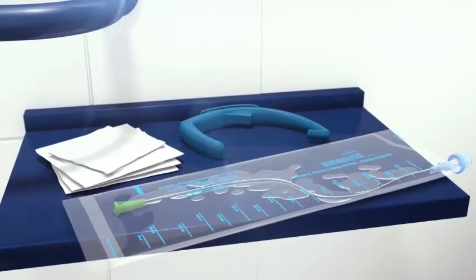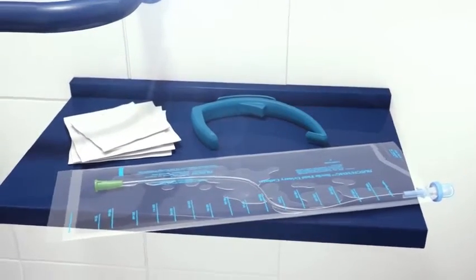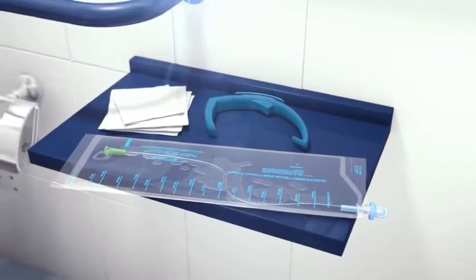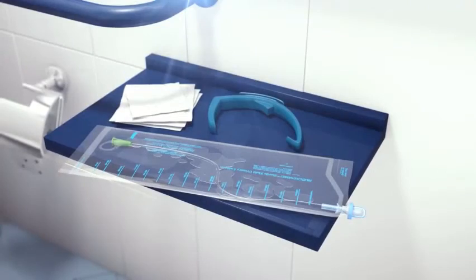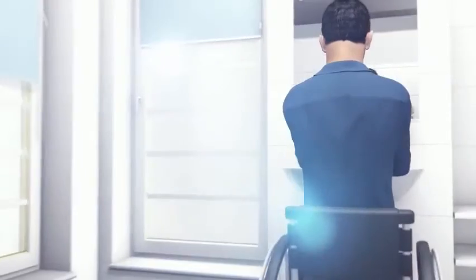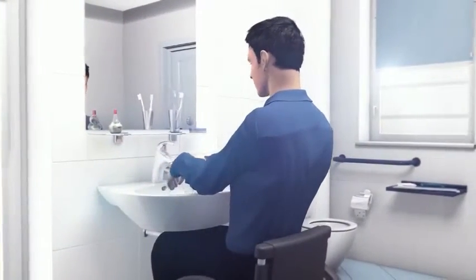For catheterization, you will need a MMG close system, antiseptic for cleansing the urethral opening or meatus, and if needed, the freehand catheter device from Teleflex. After gathering all the supplies needed, wash your hands thoroughly before performing your catheterization. Having clean hands is one of the best ways to help reduce the risk of infection.